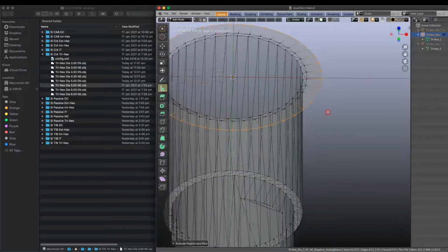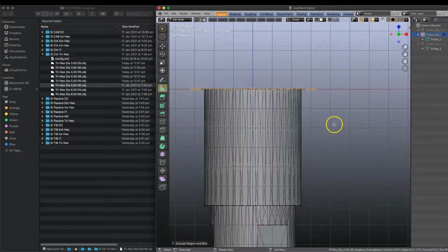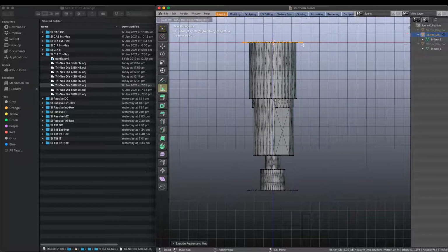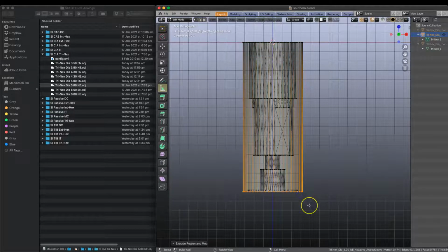Okay, so we've extruded that out. Now we have a wall thickness of approximately 0.7. We're going to view the part from the front, zoom out a little. We want to extrude our edge loop that's highlighted downwards into the Z direction. So press E and Z. Pull it all the way down. Okay, and left click.